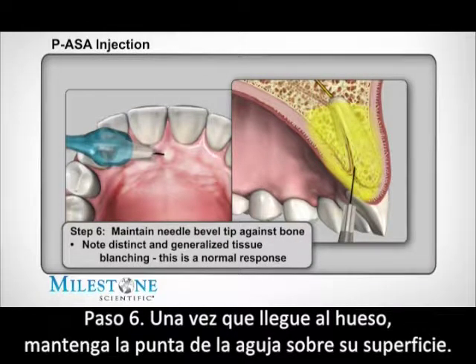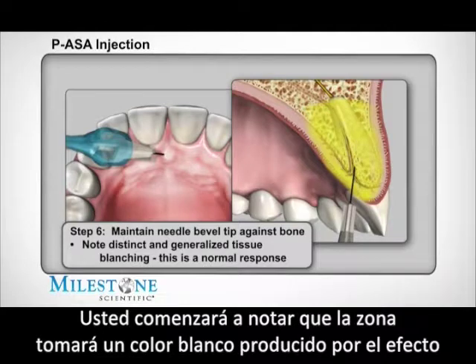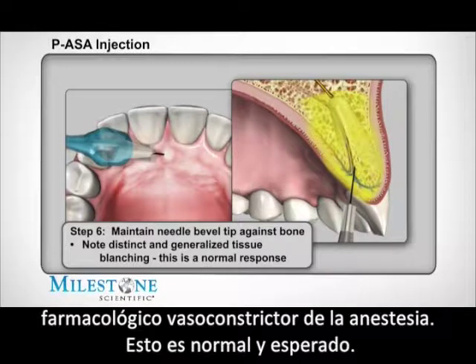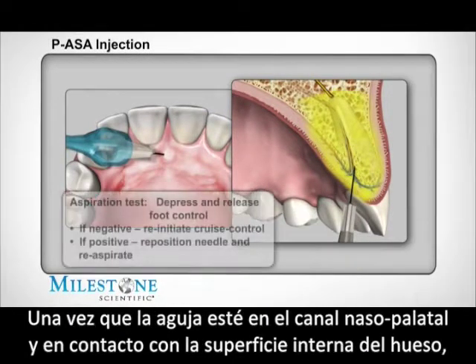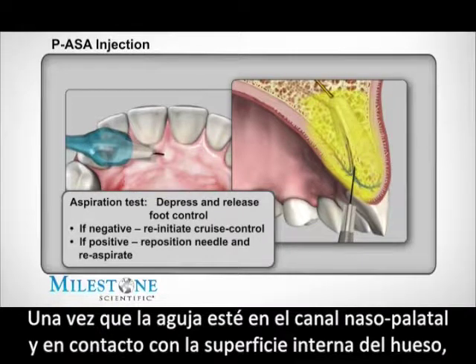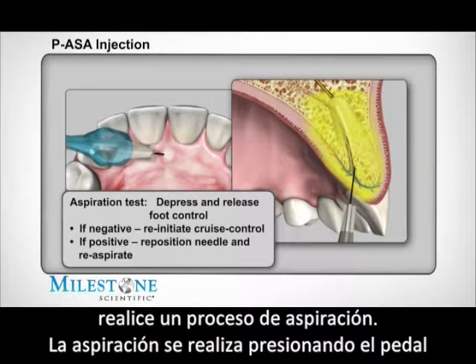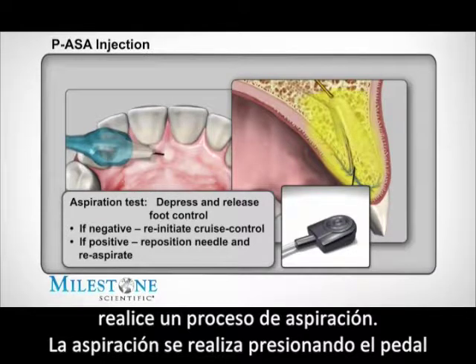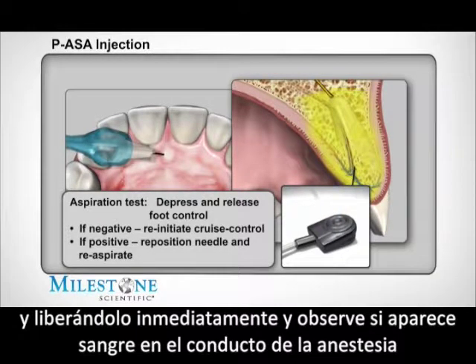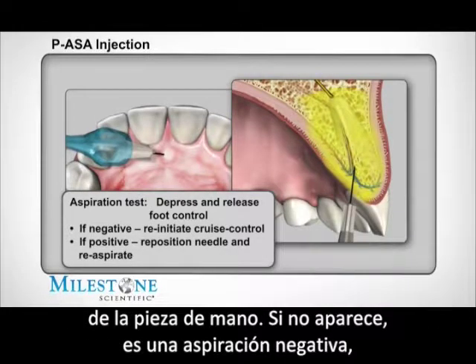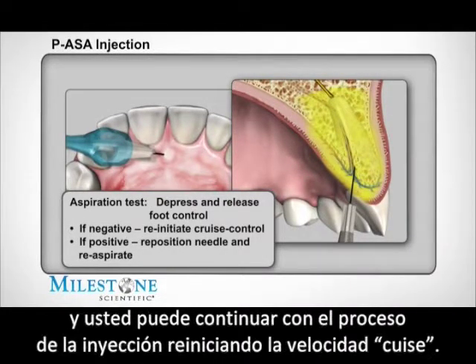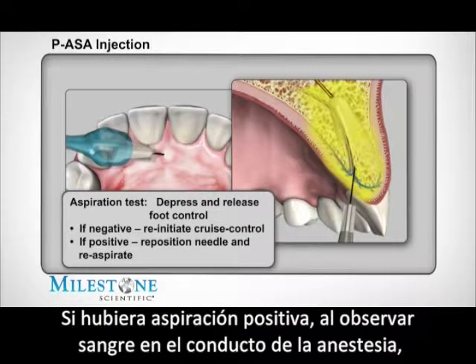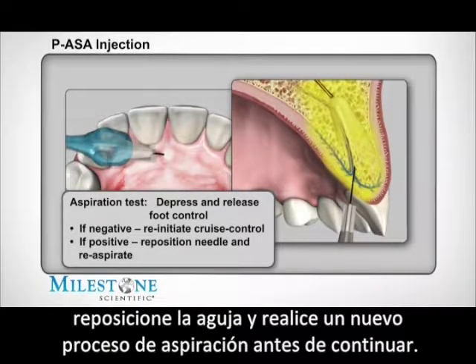Step 6: Maintain the needle bevel against the surface of bone once it's contacted. You should begin to notice distinct blanching of the palatal tissue as an effect of the vasoconstrictor in the local anesthetic — this is normal and to be expected. Once the needle is within the nasopalatine canal and contacting the inner bony wall, perform an aspiration test. Depress and release the foot pedal and observe if any blood appears in the hub or tubing. If not, this is a negative aspiration and you may continue the injection by re-initiating cruise control. If there was a positive aspiration, reposition the needle and re-aspirate before continuing.